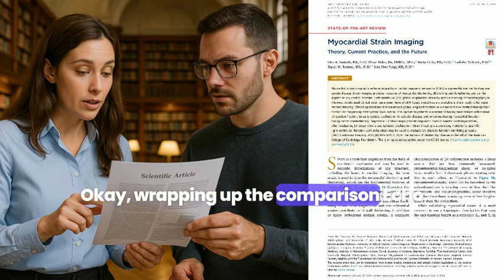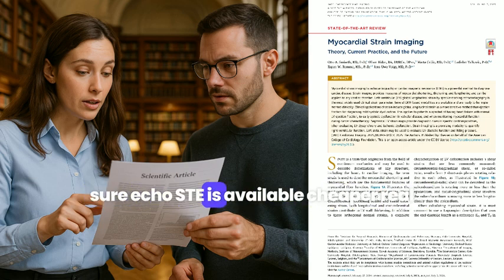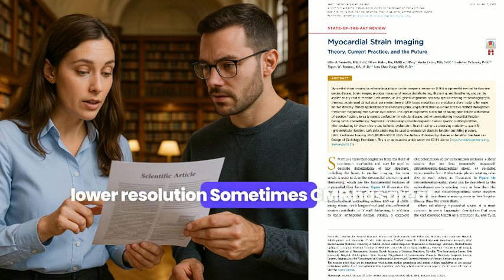Okay, wrapping up the comparison, echo versus CMR for strain. Quick pros and cons. Sure. Echo, STE, is available, cheaper, real-time, angle-independent. Cons: window-dependent, lower resolution sometimes.